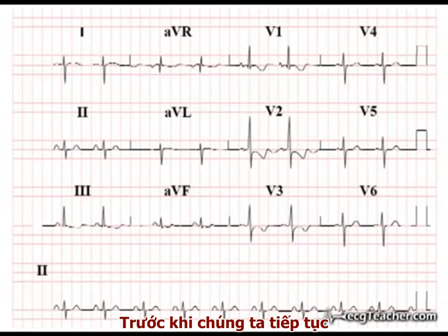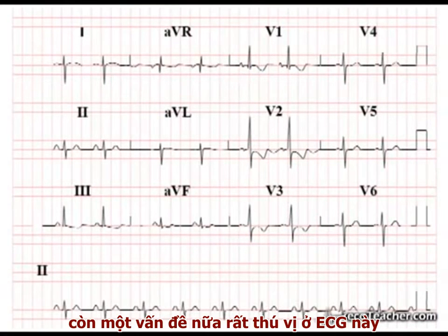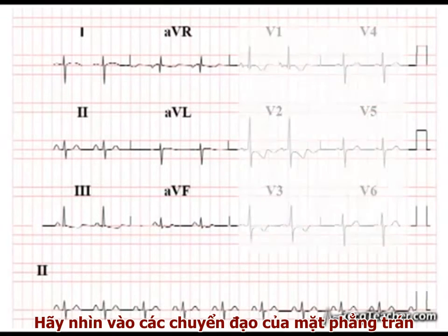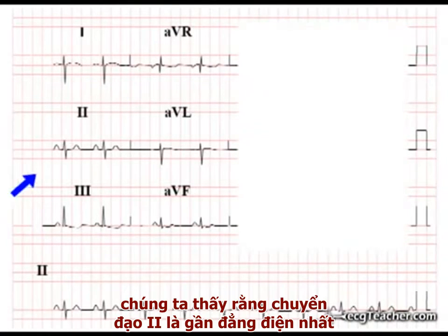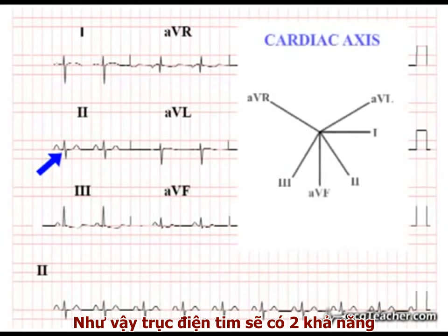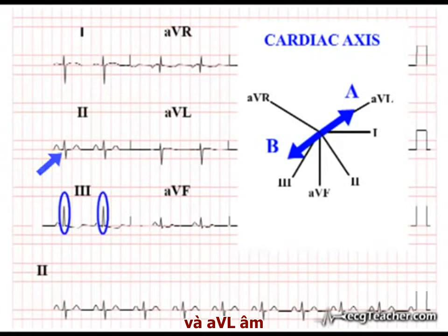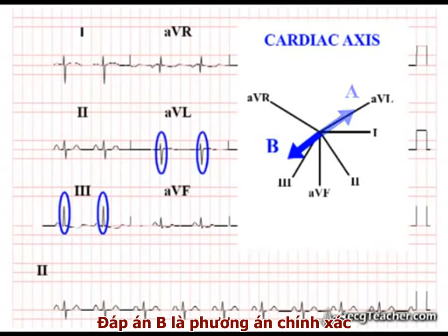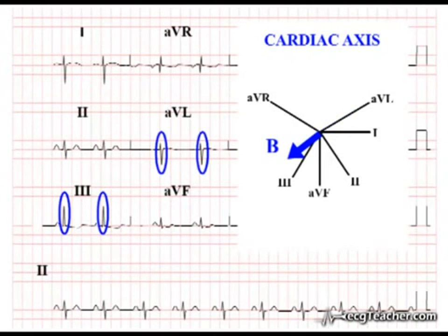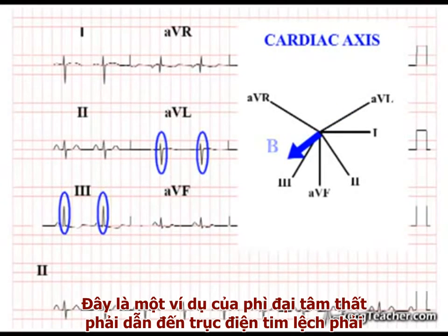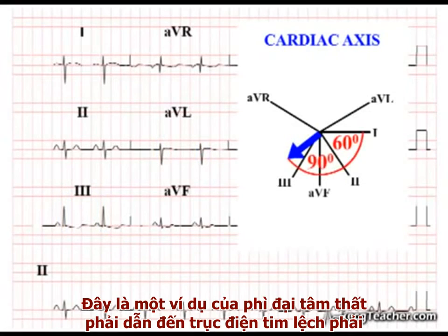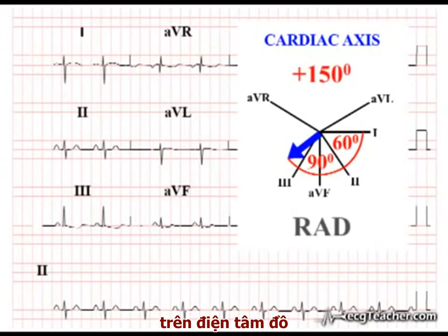Before we move on, there is at least one further feature of interest on this ECG. Looking at the frontal leads, we note that lead 2 is isoelectric, giving two possible cardiac axes at right angles to this lead. As lead 3 is strongly positive and AVL negative, option B must be correct. This is an example of RVH resulting in right axis deviation on the ECG.